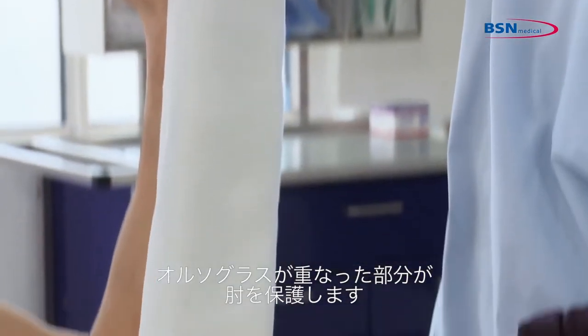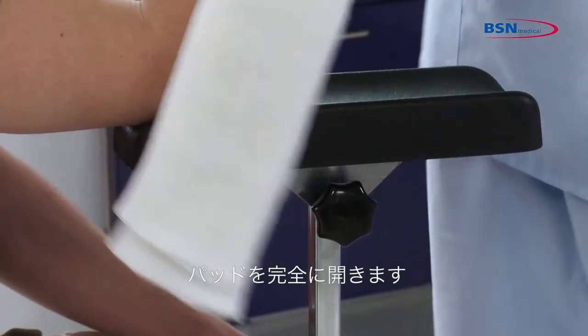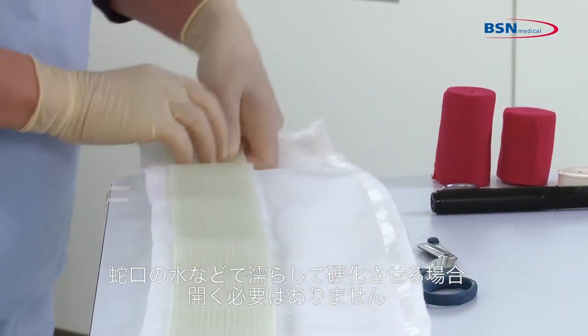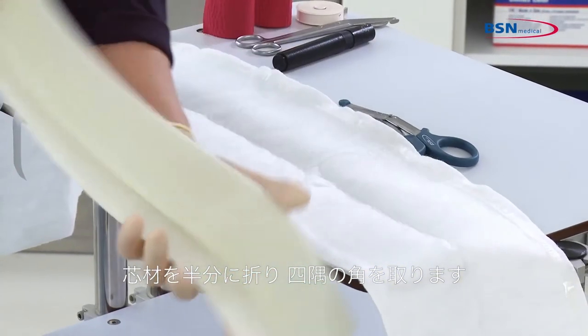The overlapping part of the splint provides elbow protection. You can open the pad completely. If you use a bucket of water or faucet for water activation, you do not need to open it. Fold the splint in half and round the edges.